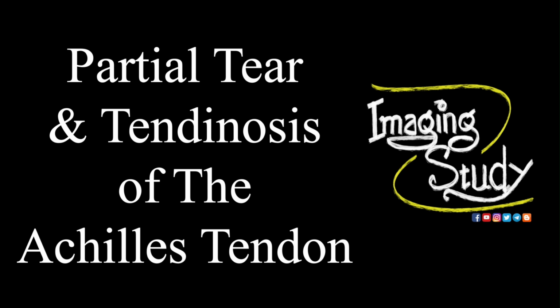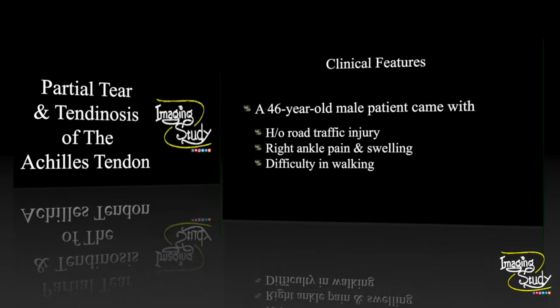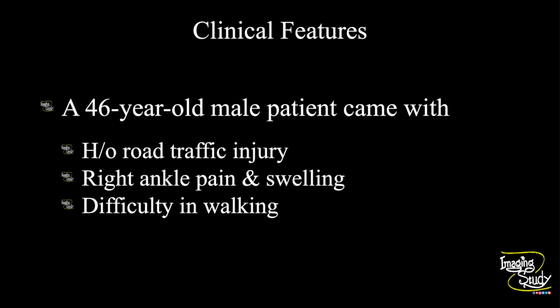Today we are going to see a case of partial tear and tendinosis of the Tendo-Achilles. A 46-year-old male patient came with a history of road traffic accident. It happened around a month ago. Then he developed right ankle pain and swelling. He complained about the difficulty in walking.